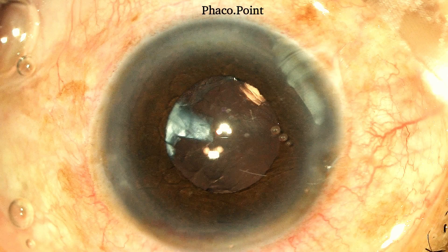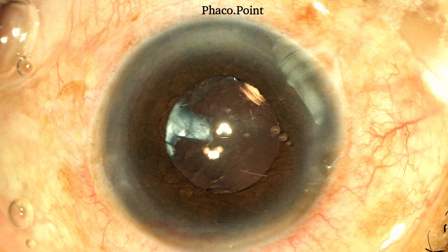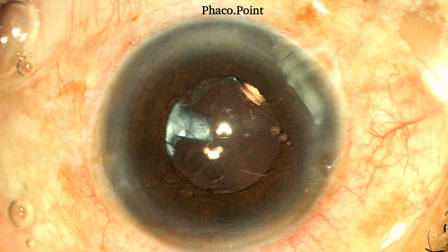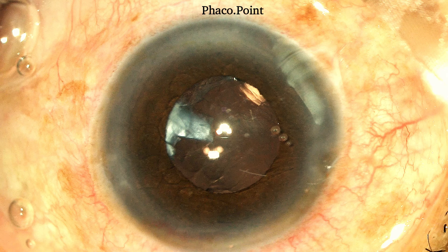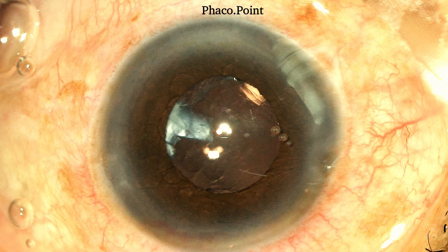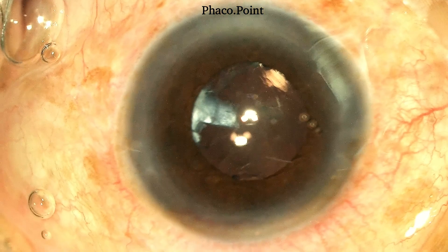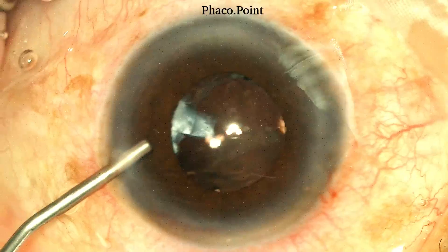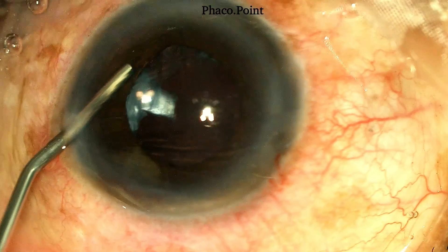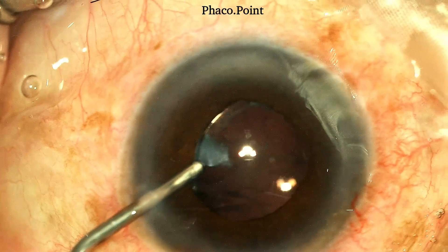At this point, note that the residual cortex at the 4 o'clock position exactly overlies the PCR. In order to prevent any vitreous herniation through the PCR, I now choose to inject a dispersive viscoelastic behind the IOL in the area of the PCR.